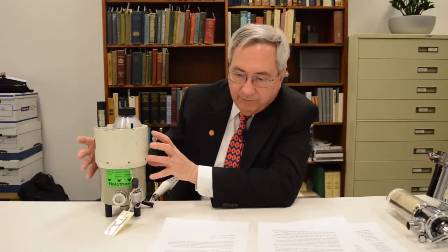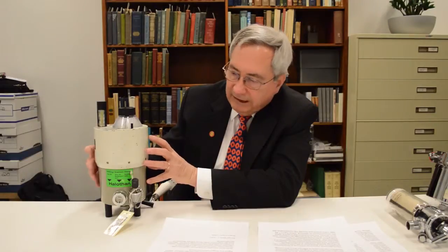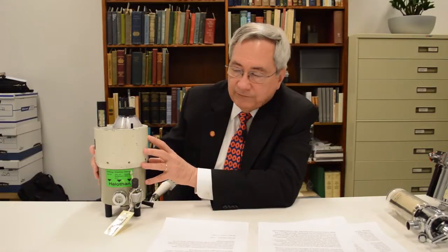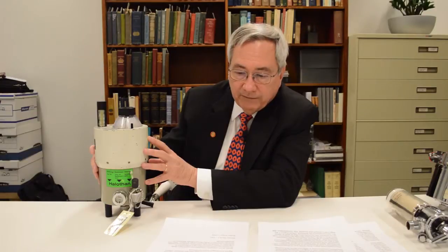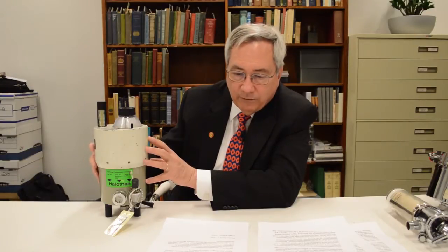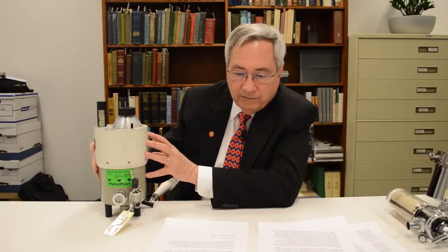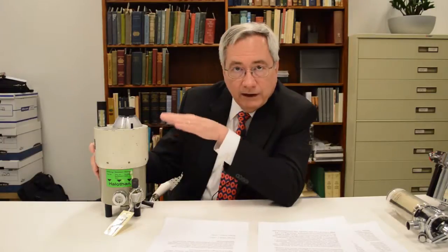Now, as an additional feature, the Vapor contains a substantial amount of copper. This thing weighs a little over 30 pounds. And that provides for good heat transfer and greater temperature stability of the liquid anesthetic within the vaporizer. And as a result, the Vapor delivered a very predictable concentration of halothane vapor, even at quite low flows below 1 liter per minute.